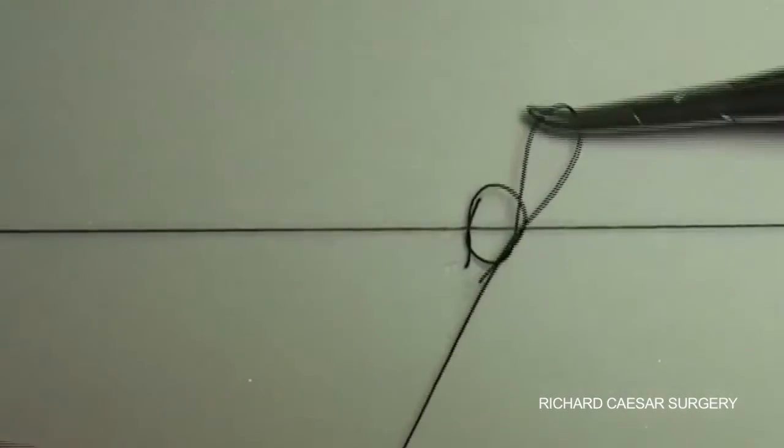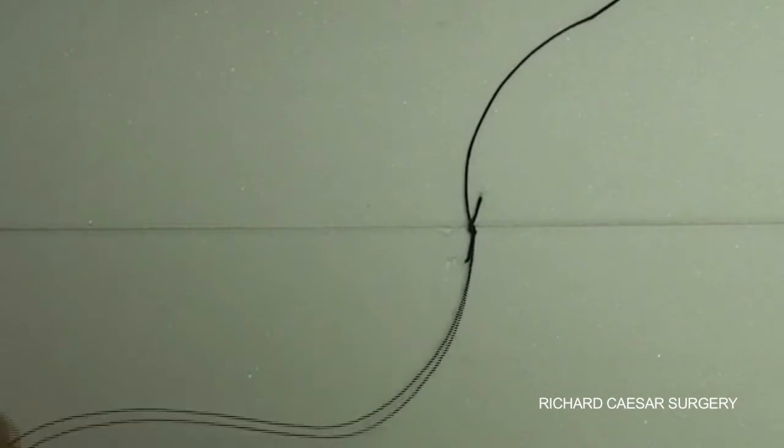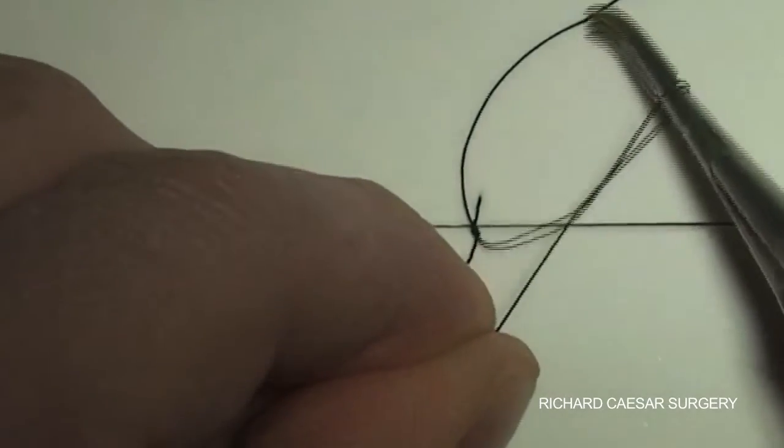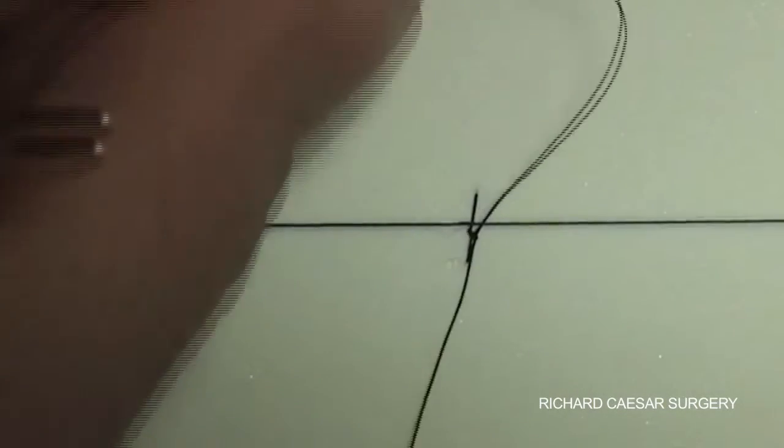The interrupted suture needs to be a reef knot, that is then locked with a third knot. But a surgeon's knot of two throws with one throw, followed by another one throw, is also acceptable.